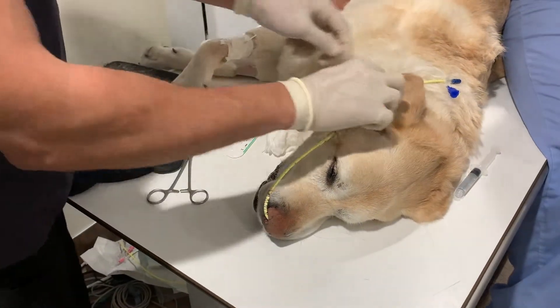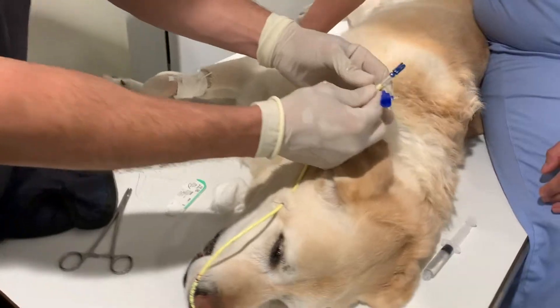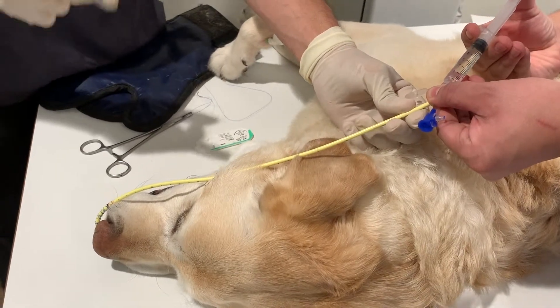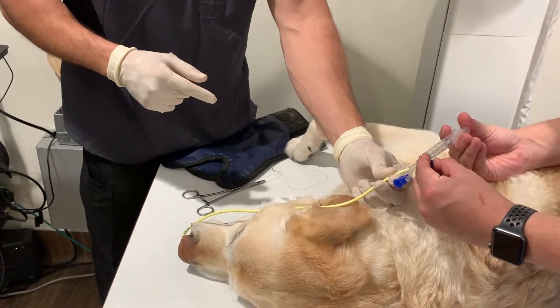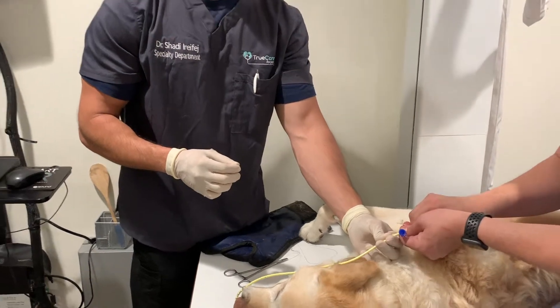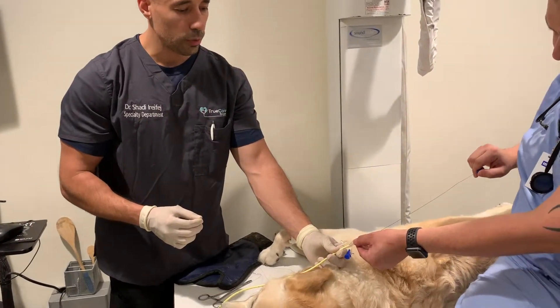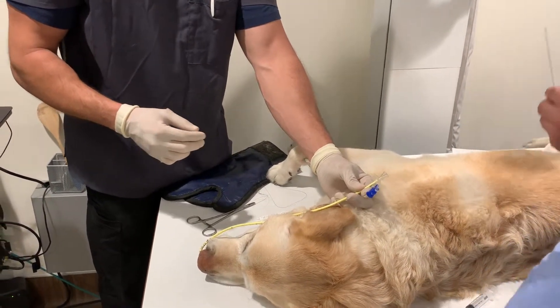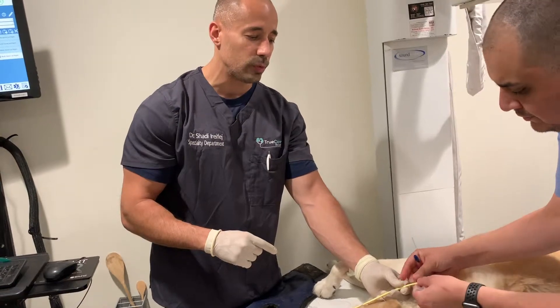The next step — the feeding tube, in order to make it more rigid, has a stylet in it, and so we have to pull out the stylet. One of the tricks we'll commonly use is to place some saline into the feeding tube first. It's very important that you make sure the feeding tube is actually in the stomach when you do this, because if you're in the airway by accident you're going to cause a really bad pneumonia. Once you place the fluid in the feeding tube it'll help lubricate the stylet. The stylet is a very thin metal wire that helps with the rigidity of the feeding tube — that way it's easy to place. You can see we're pulling out the stylet and it's coming out really nice and smooth. If you didn't place saline in there, sometimes it won't cause a problem, but other times removing the stylet will cause wrinkling of the feeding tube.